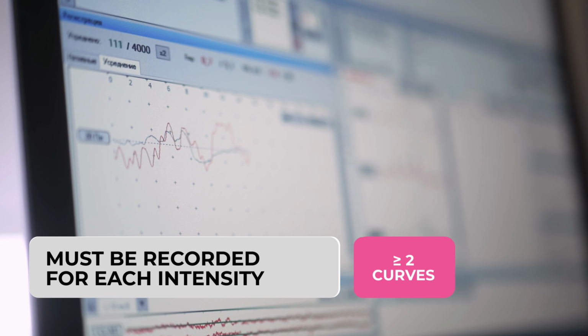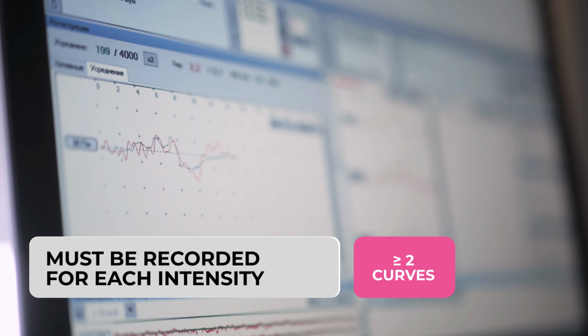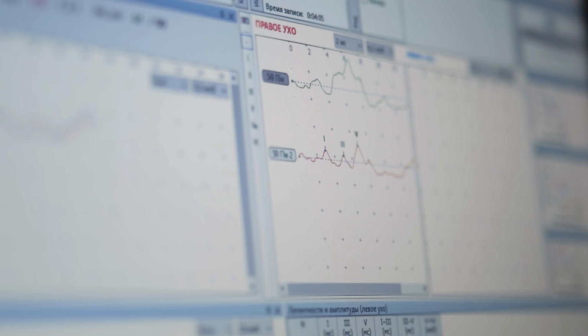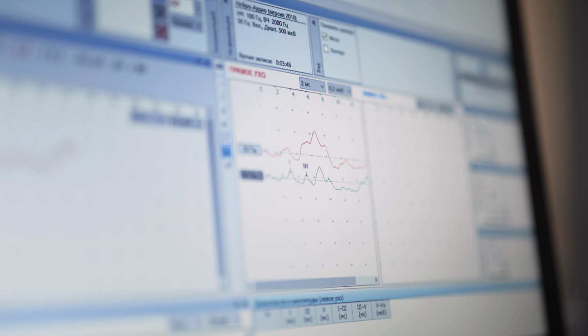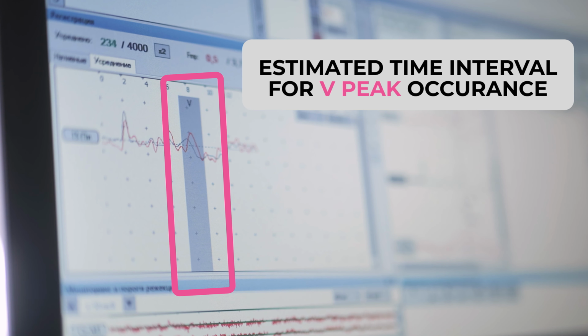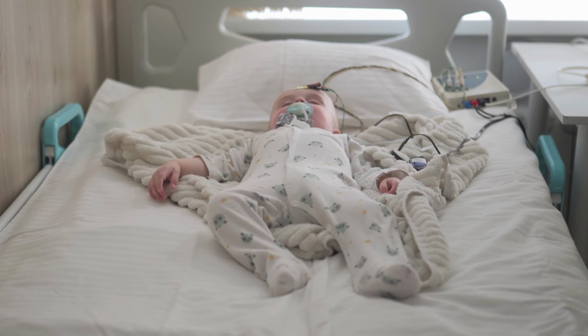The recording is started. At least 2 curves for each intensity should be recorded to compare them to each other and make sure that the peaks match. Only in this case we can be sure that the recording is correct. Then the peaks are arranged. The estimated time intervals of peak occurrence are shown on the graph by gray vertical bars. The time intervals depend on age, so it is very important to enter the child's exact date of birth.